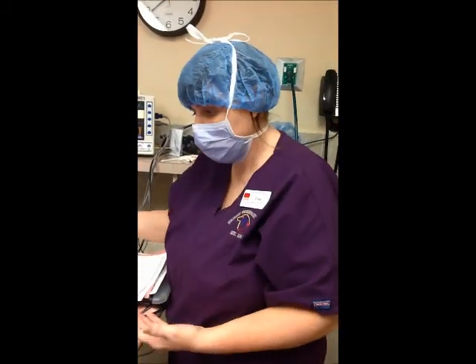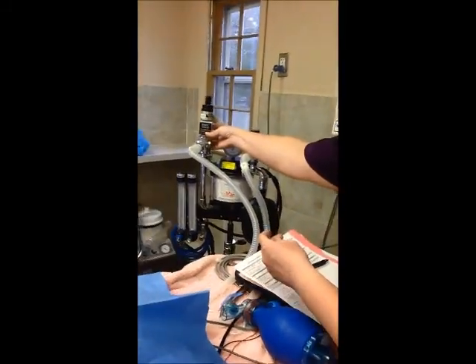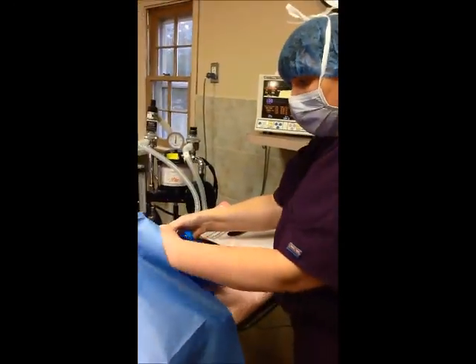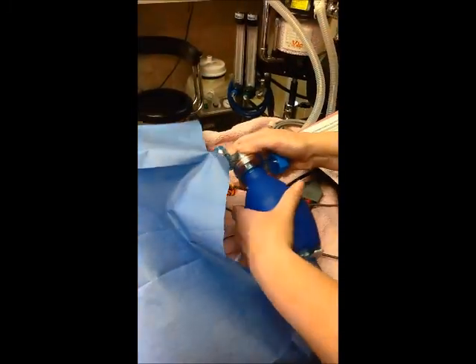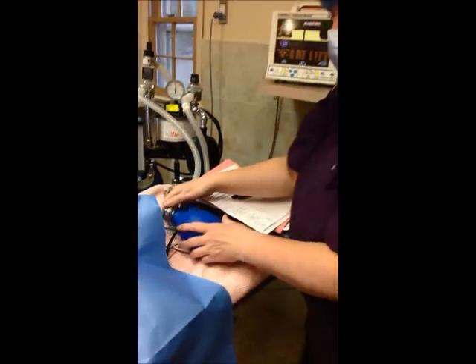Okay, if my patient was to go into respiratory distress, you could use the machine itself as an ambu bag. We have a safety relief switch over here that we can include and then squeeze the bag down to give them a breath. Or we could use the ambu bag, and the ambu bag hooks up to the E-tube, so you would just replace it with this, and then you would give her short breaths as you did CPR on her.